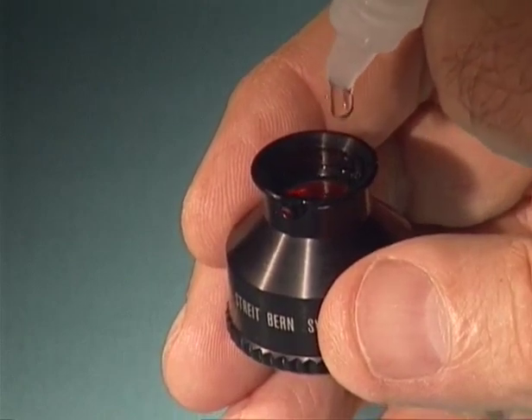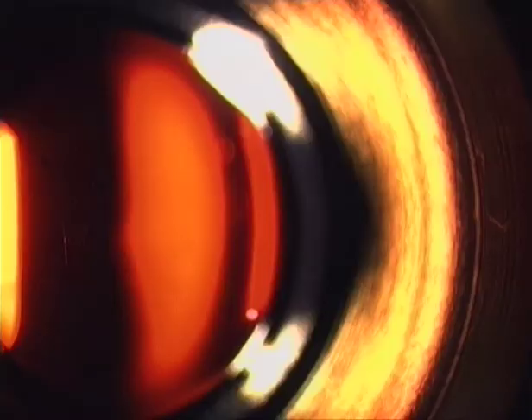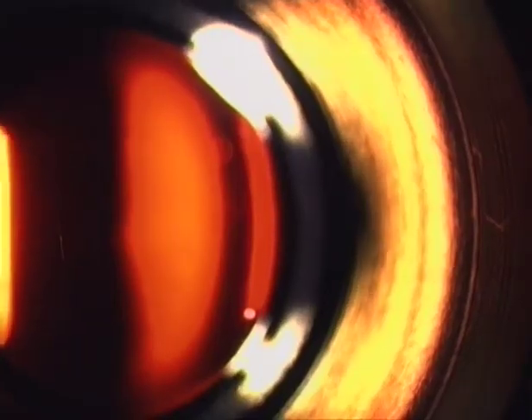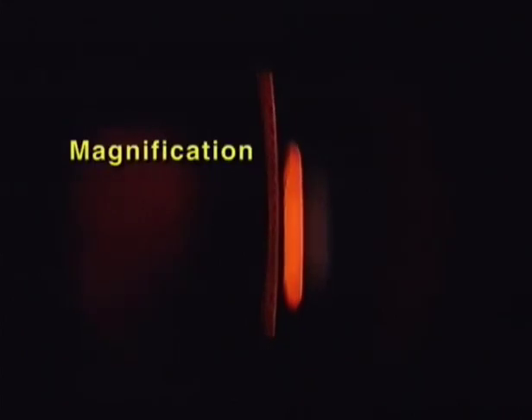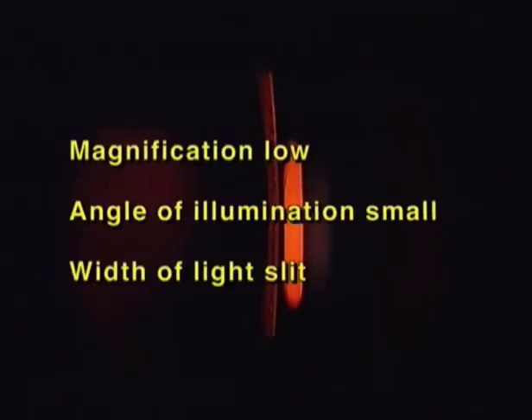Before using the contact glass, its cavity is filled with a viscous lubricant. To start the examination, the light is brought to the center of the contact glass with 3 parameters preset at small values, that is, magnification low, angle of illumination small, width of light slit narrow.